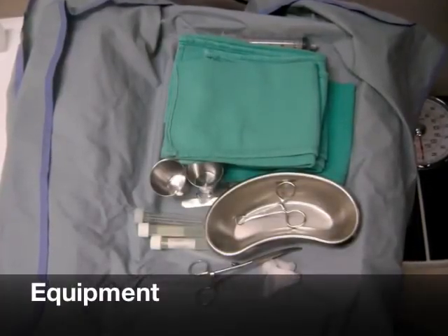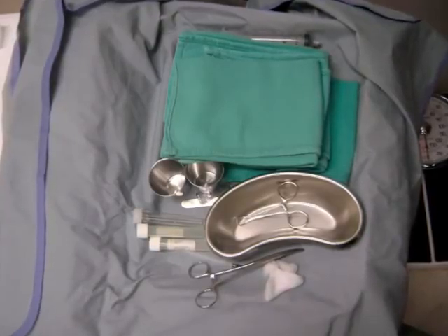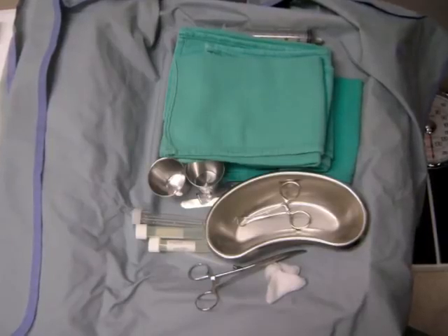Lumbar puncture should be performed in a sterile manner. You will need to put on a gown, gloves, and a mask. This is not shown in this video so that you can more easily see the hand movements required.